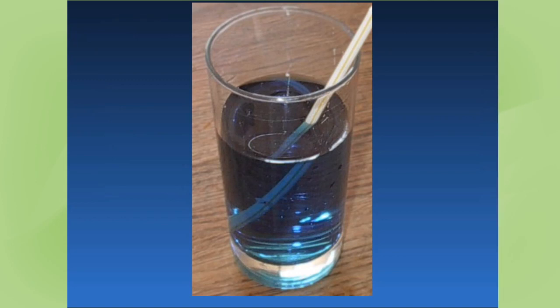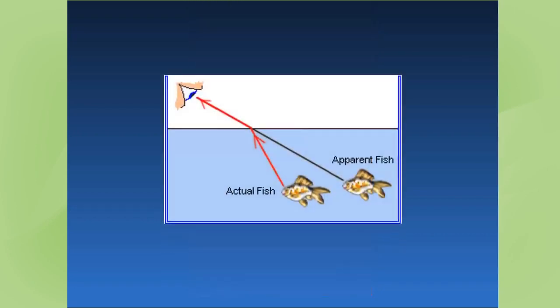So refraction is the bending of the wavefront as sound or ultrasound passes through different media with different propagation velocities. So this is dependent not only on the propagation velocity of the medium, but also on the frequency of the waves. And this is how rainbows occur. It occurs by refraction, and that's why it splits out into the rainbow colors, because it's dependent on the frequency.